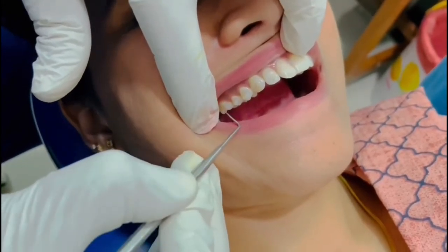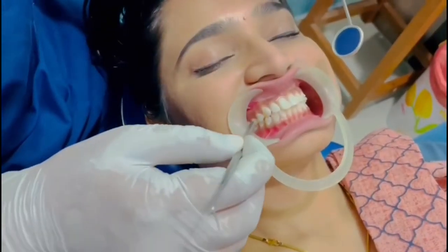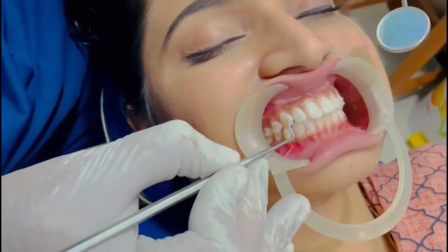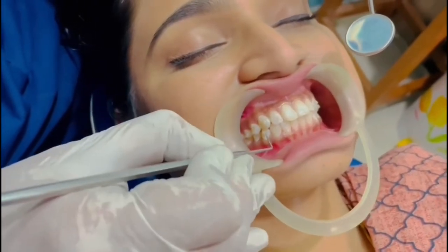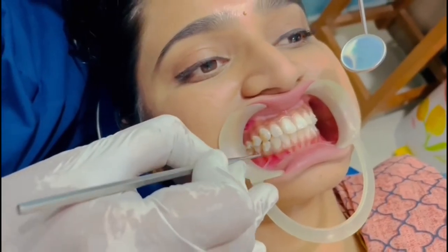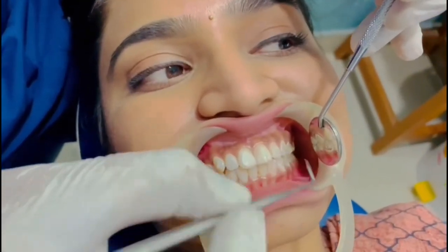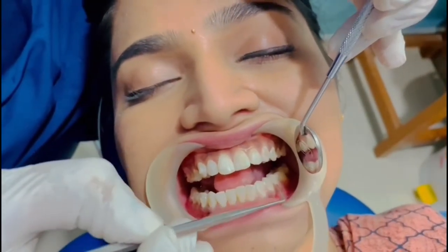Now we will be placing the attachments on the molars. Now we have placed attachments on every tooth as indicated in the chart. You can see on the lower teeth also.